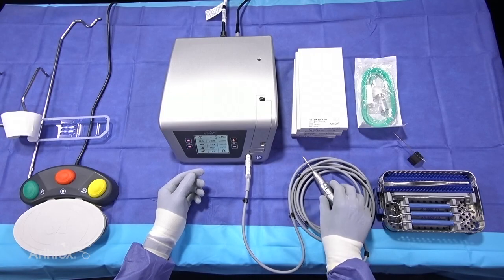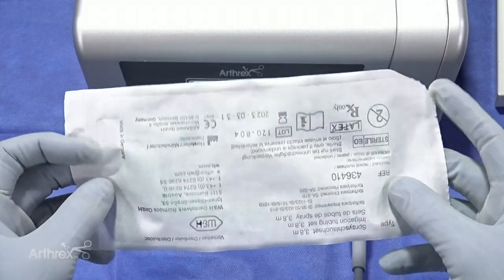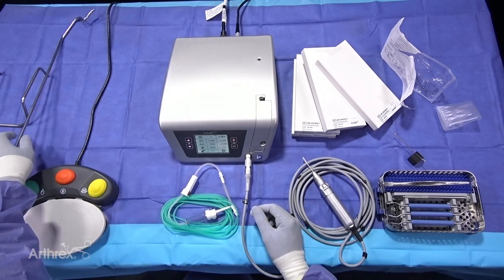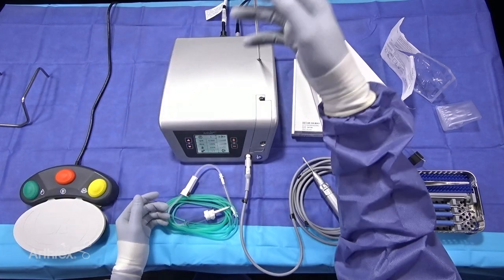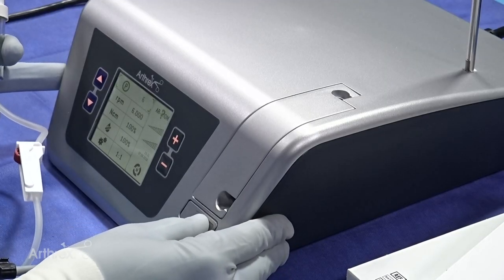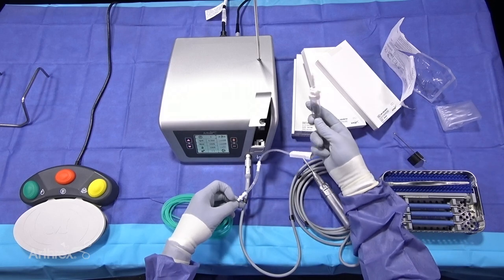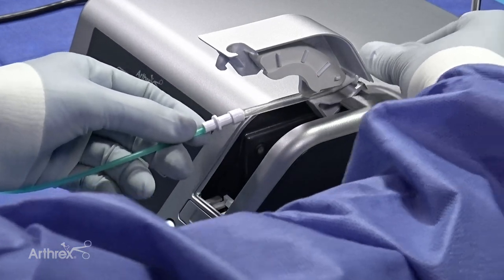The AR200 unit also has a built-in pump. This is a single-wrap sterile pump tubing that comes in a box of six. In the box when you order the AR200 is your IV pole, which hooks into the top of the AR200 unit so you can hook your irrigation to it. You press a button on the AR200, it pops open your pump tubing mechanism, and you take the pump tubing — this end goes towards the IV pole — and simply connect one end to the bottom there.